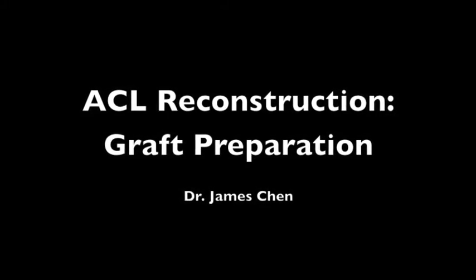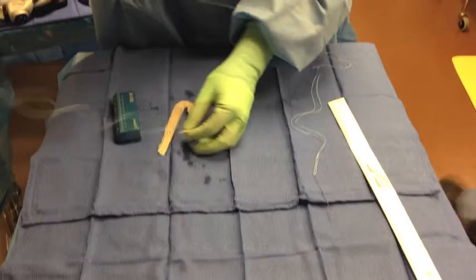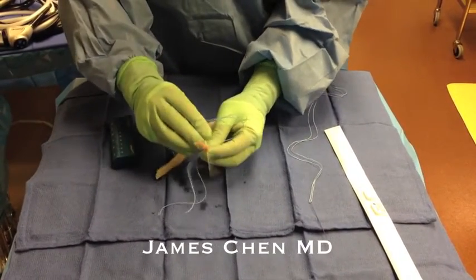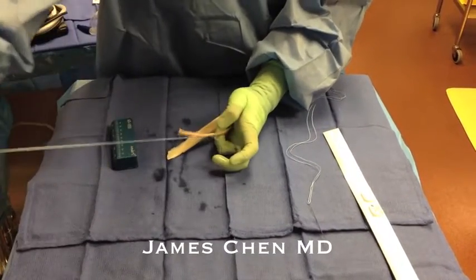This is a video of ACL reconstruction graft preparation. Here I am on the back table whip stitching with an Arthrex fiber loop on allograft.